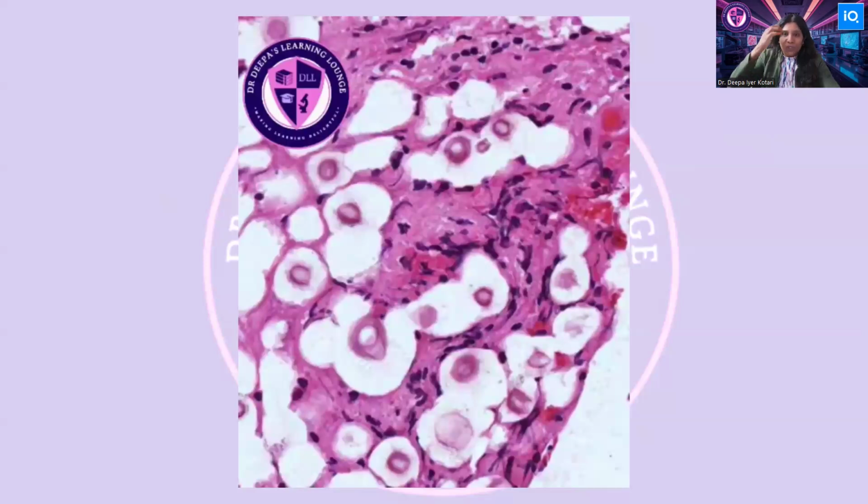Another important differential is Histoplasma capsulatum. Histoplasma is another important mimic. These organisms are much smaller, roughly the size of half of an RBC, which is 3 to 5 micrometers. They exhibit about the same narrow-based budding that cryptococcal organisms show. The characteristic differential is that Histoplasma is more intracellular. You see them in macrophages mostly, and their intracellular location is an important clue.